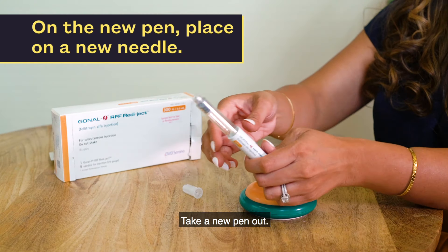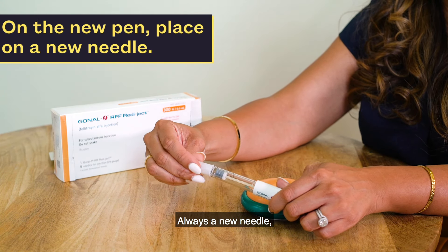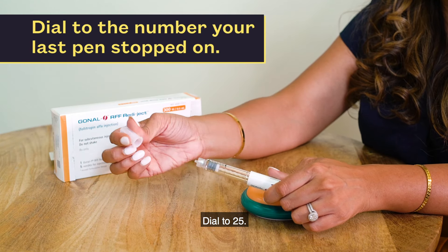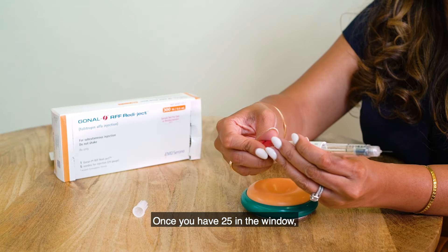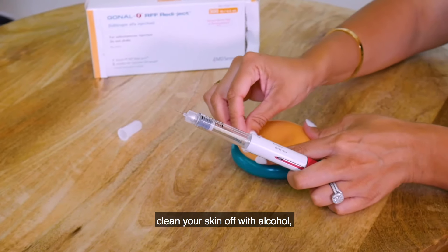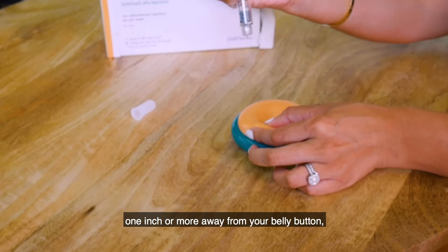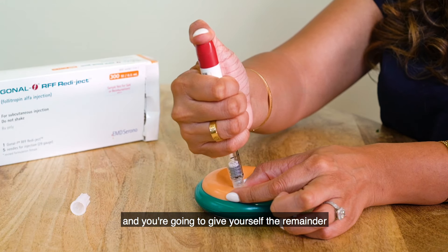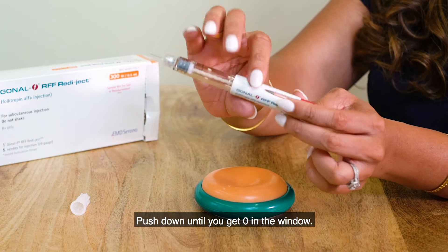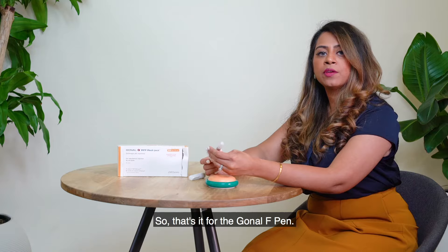Take a new pen out. On the new pen you're going to place a new needle — always a new needle, remember these are single-use needles. Place a new needle and dial to the remaining amount, for example 25. Once you have 25 in the window, clean your skin off with alcohol on the spot you've selected — one inch or more away from your belly button — and give yourself the remainder of the medication. Push down until you get zero in the window. You should see zero every single day. That's it for the Gonal-F pen.